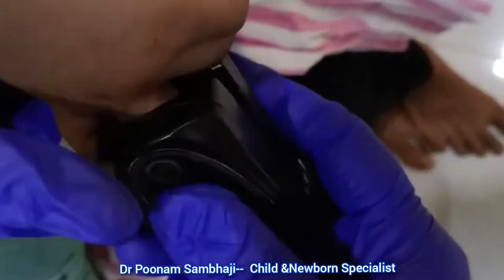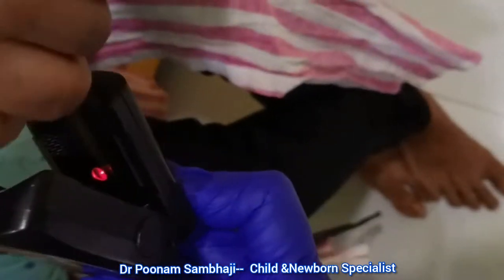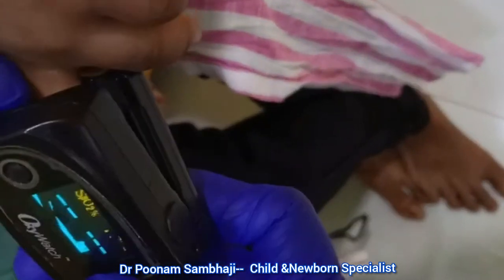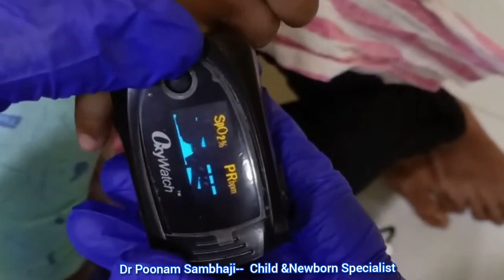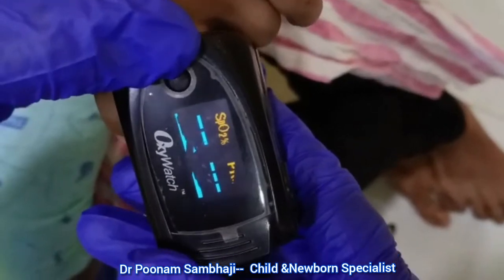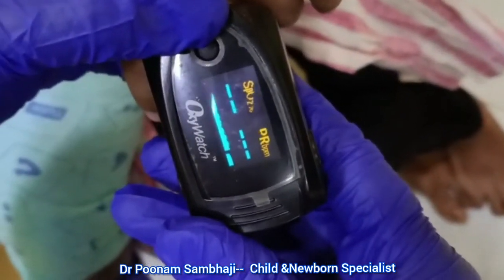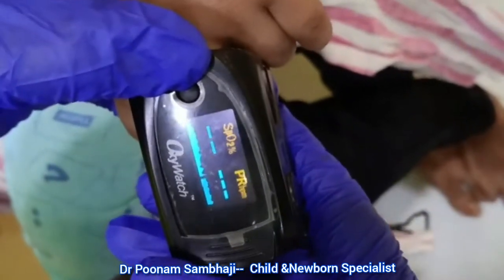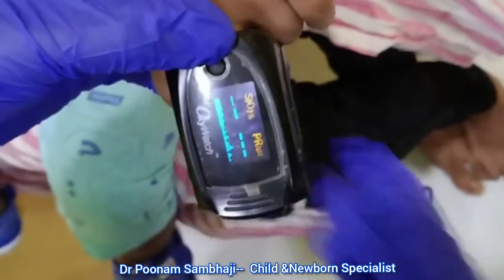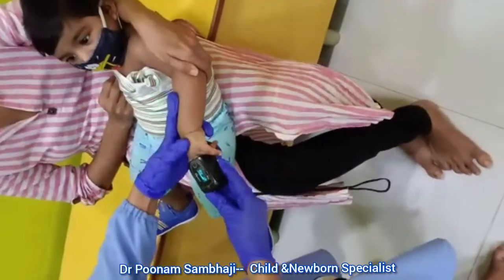Once I put it on, there will be a red color glow. So this is the sensor. The finger pulp should rest on it, and then just put the clip on and read the readings that will flash on your pulse ox. Now it takes some time for the pulse ox to sense the reading, so wait for at least 15 to 30 seconds before the waveform stabilizes. There are some pulse ox which do not have a waveform but just lines coming up and down.